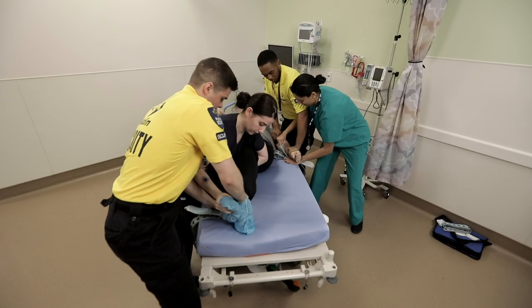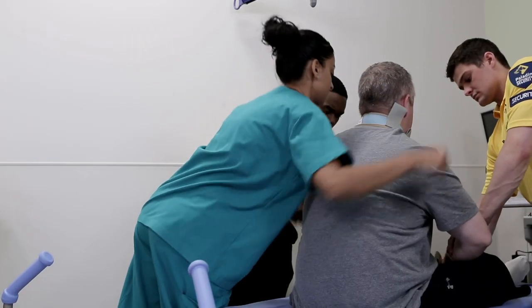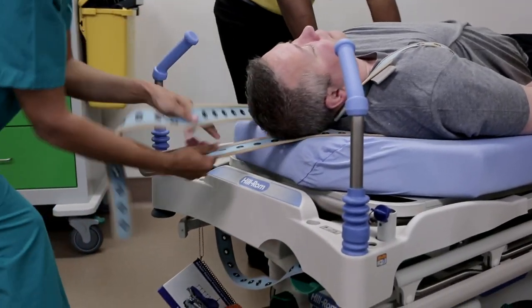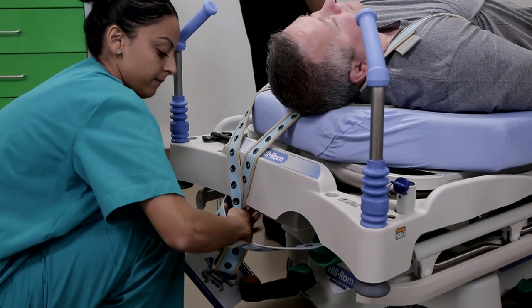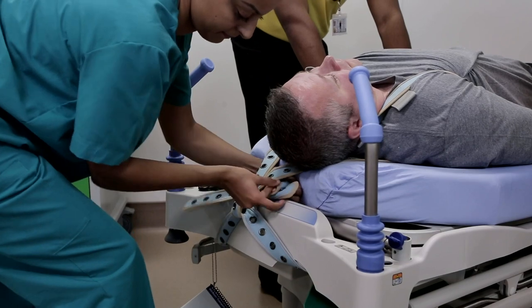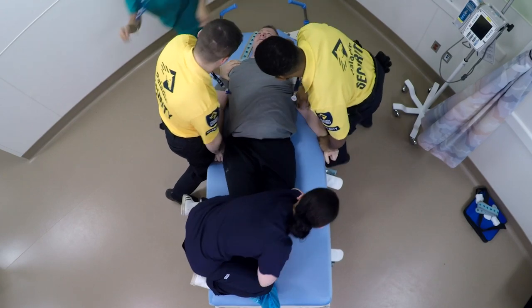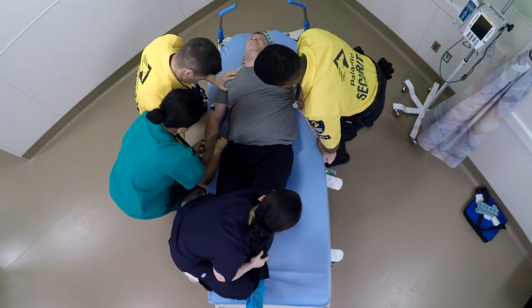With only a team of four, the team leader needs to wrap the first wrist. To do so, the leader must first wrap the torso control belt behind the patient to prevent the patient from lifting. The leader can do this by wrapping the straps into a temporary knot or by securing the end straps with a lock. The leader, using Velcro, wraps the first wrist while it is held securely by the other staff member.